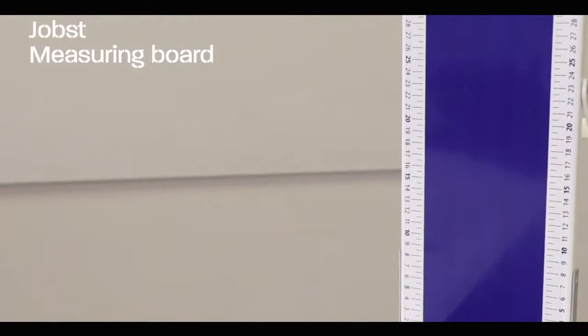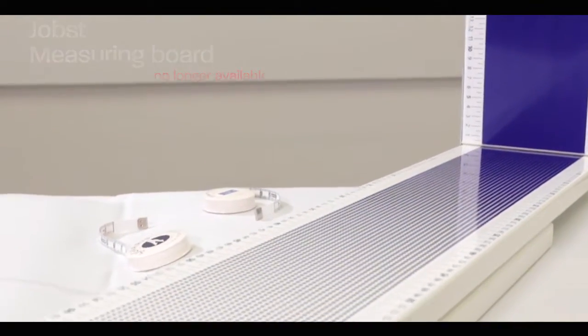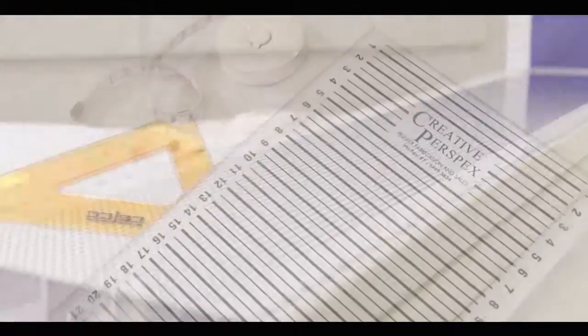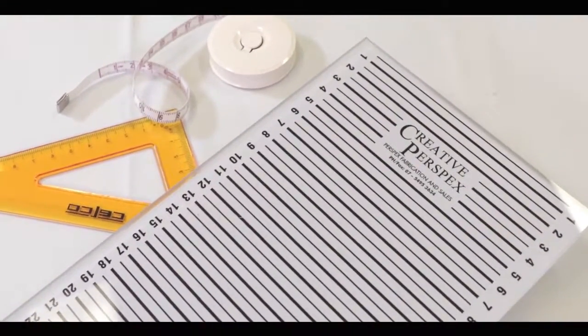This JOBST measuring board, featured in the Australasian Lymphology Association measuring standards, is no longer available for purchase. The board shown in this presentation is available from Creative Perspex in Caboolture. Medi Australia also sells measuring boards.